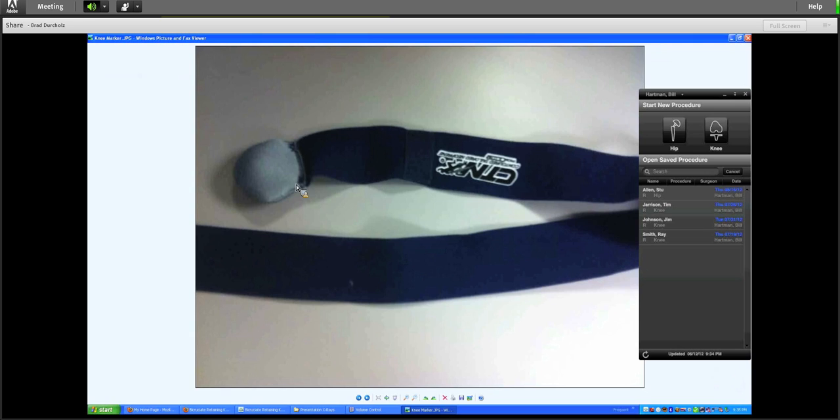And by that I mean, if you're looking at the front of the knee, the AP view, then you want that sphere in the center between the front of the knee and the back of the knee. So that would be basically right in front of the fibula head as a reference point. Conversely, if you're looking at a lateral view of a knee, then you need to have that marker in between the medial side and the lateral side of your knee, and the tibia tubercle is a good reference point for that. We've got that information, and we'll get that to you. We've got videos out on YouTube that this guy, Paul Beck is his name, who wrote the software, has already produced, and we've got help screens and everything else. So that's some information that we want to make sure is clear.